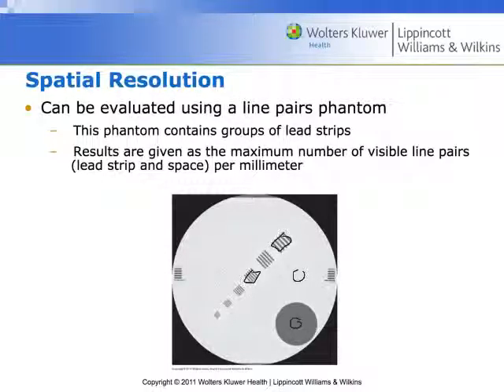The image itself is also reporting how well the rotation is aligned to the phantom, because with these little fellas on the side, you can see that those line pairs look more or less identical, like they have a long line at the bottom and then a series of short lines above. As you're scanning through the phantom, those lines are placed at different intervals so that you can make sure the phantom isn't crooked in the gantry.